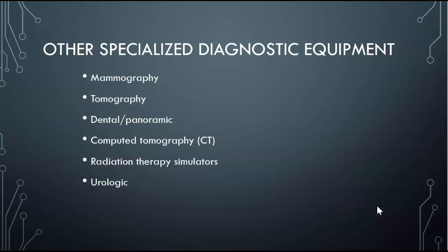So if you want a 1 centimeter slice at the level of 6 centimeters off the table, it gives you a good slice of the kidneys. Okay, so we use it in breast imaging. It gives us 3D breasts, which are the new latest greatest thing, and everyone's going to it.